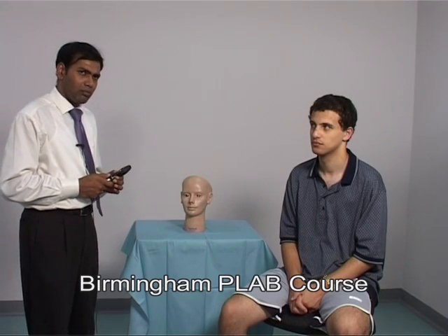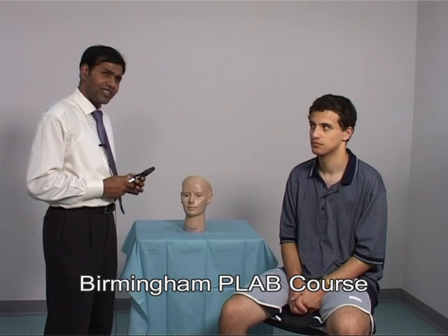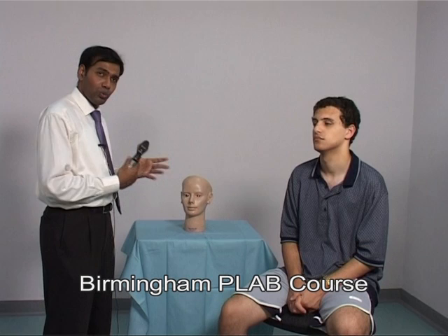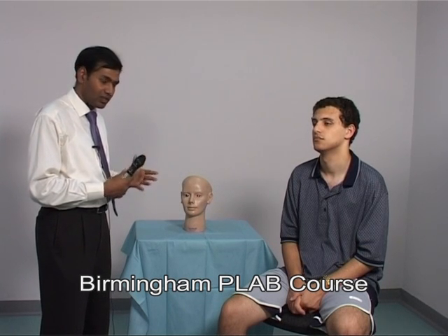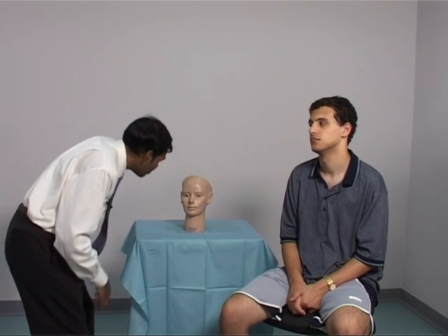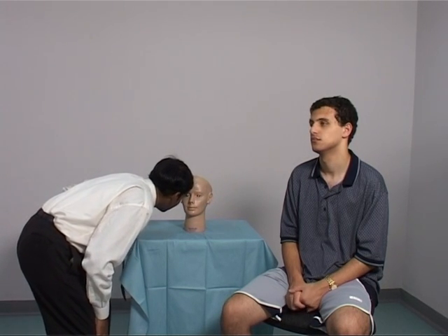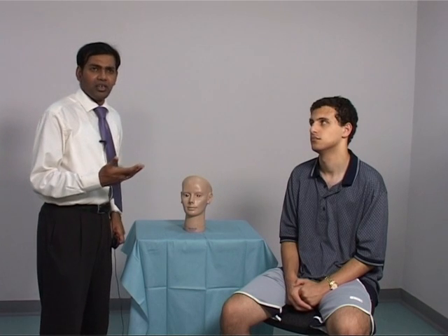Also, I've been told by some candidates that examiners often advise the candidates to approach the mannequin with your own bare eyes in this manner. You would want to again study the optic disc, the four quadrants and the macula and comment on them.